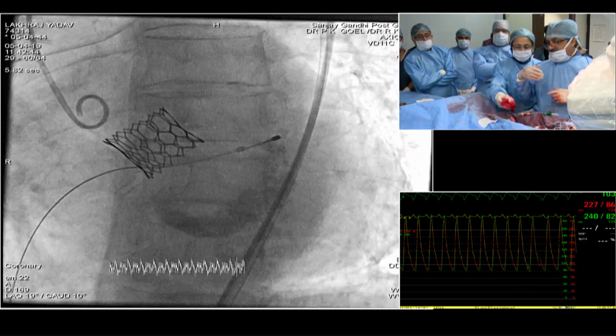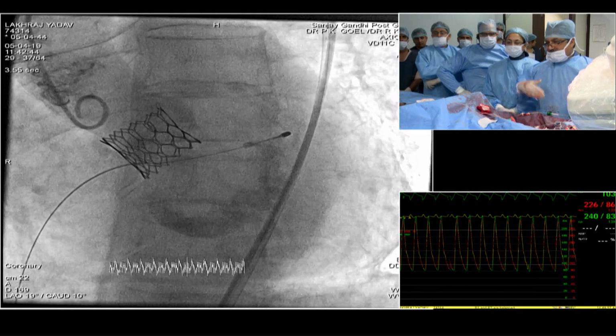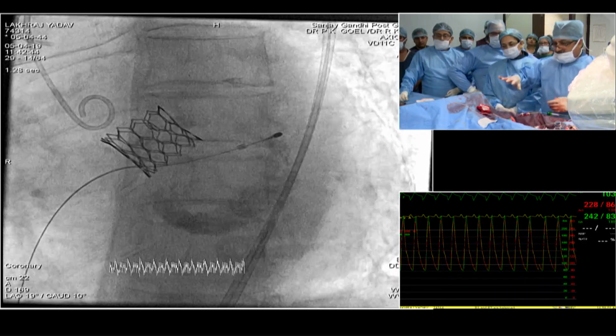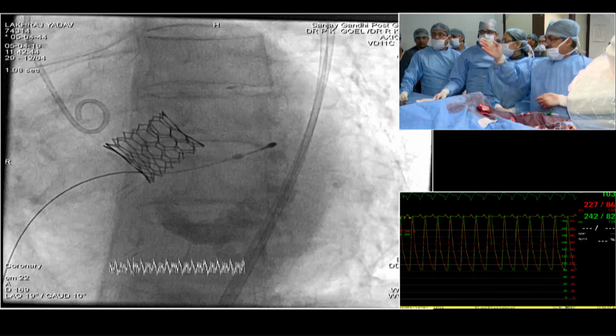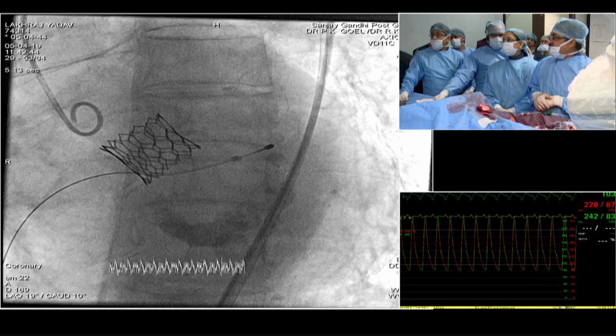And then, in spite of whatever happened, I thought they would come to us. You went outside somewhere. Is he on a paced rhythm at the moment? No. Can you reduce the pacing rate? He's on a paced rhythm. Can we see at 80 how much it is? Can we reduce it to 80?